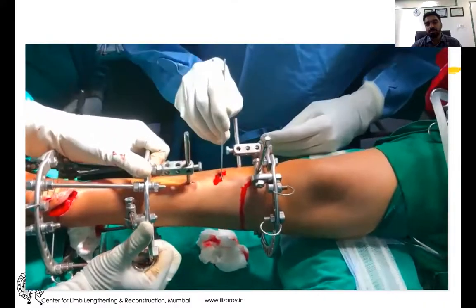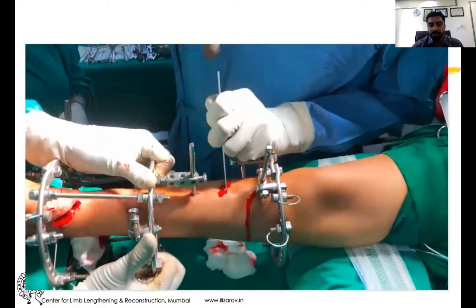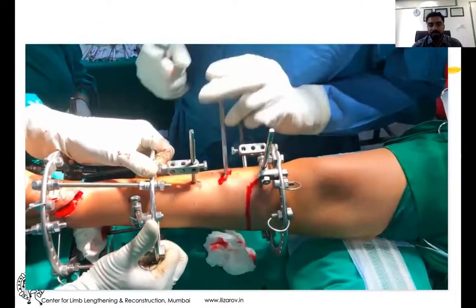Go in, go out, go in, go out — take your time and gain experience. Do it in 10 to 15 minutes.